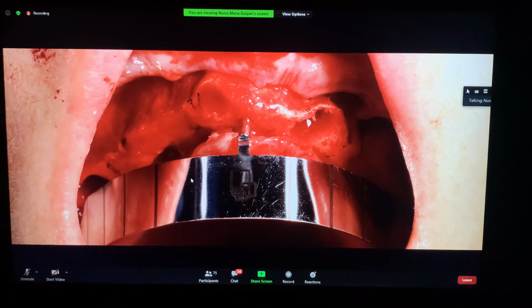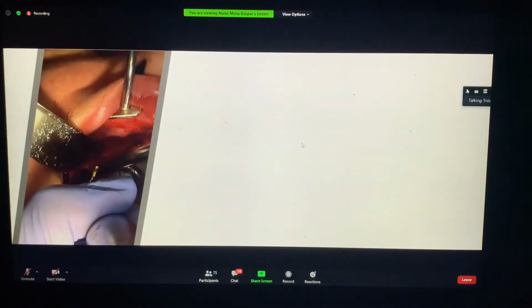So you place your guide, bẻ cong 45 độ. We bend it according to the arch form, and we can use this mark to place our implants. Và mình có thể đánh dấu lại để vẽ cong theo dạng hình cung, mình đánh dấu lại để mà mình cắm implant.